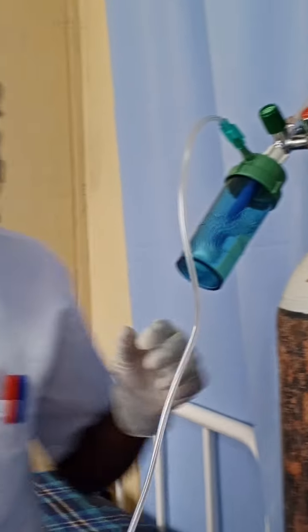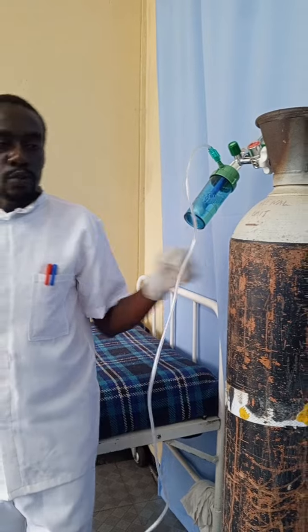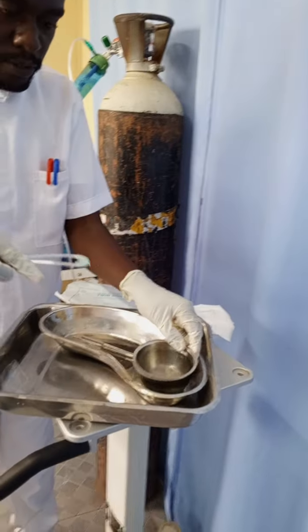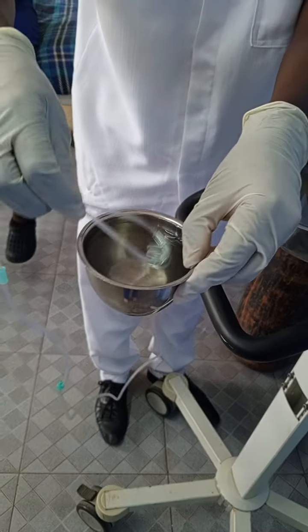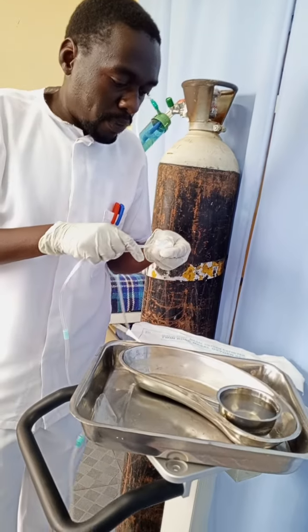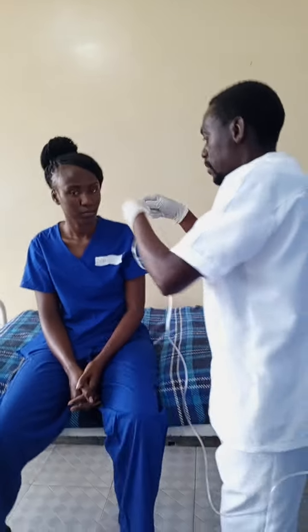Now the evidence that the oxygen is there and is open is the bubbles that are here. You see something which will be boiling. Now we are going to test if the oxygen is passing. So here are the bubbles. It means that this tube is patent. Then after that, we are supposed to wipe the excess water. After wiping the excess water, we are going to administer the oxygen to the patient.